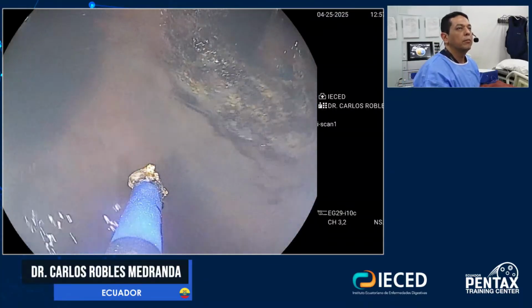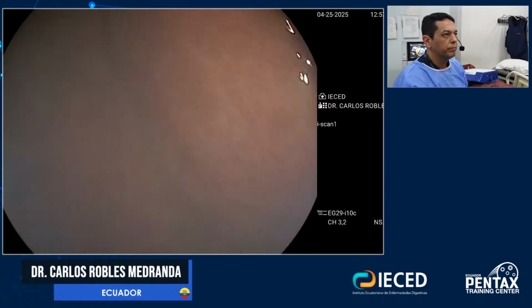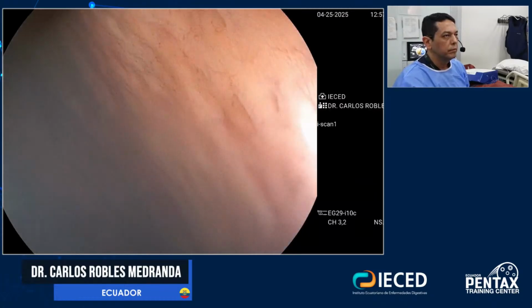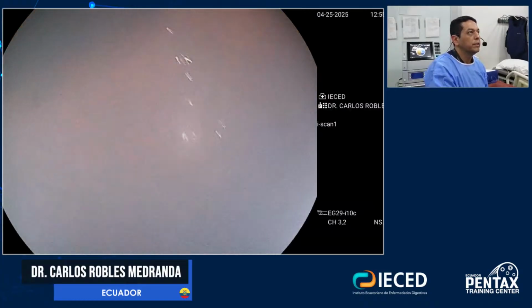So I believe we're done. Okay, let me now see here. No, quiero ver si tengo que hacerle algún cargo. So I want to see if there is still bleeding or not.